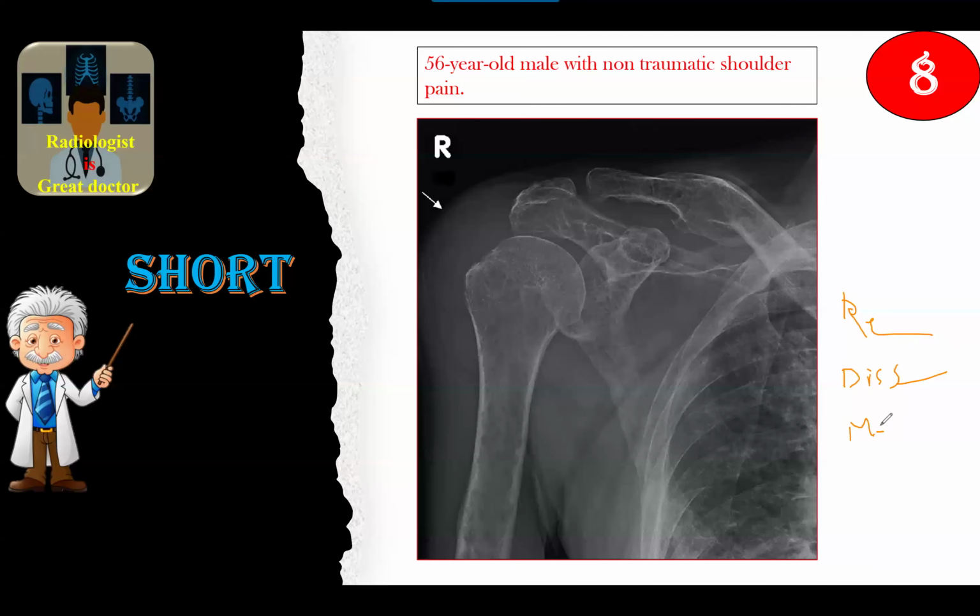And management here. I would do myeloma screening, or myeloma workup. In myeloma, we work up by skeletal survey and bone marrow biopsy. Maybe here some soft tissue swelling, by the way. Blood tests like CBC, protein, LDH, electrophoresis for serum protein and urine electrophoresis, and in the UK, I think full body MRI. Very good.